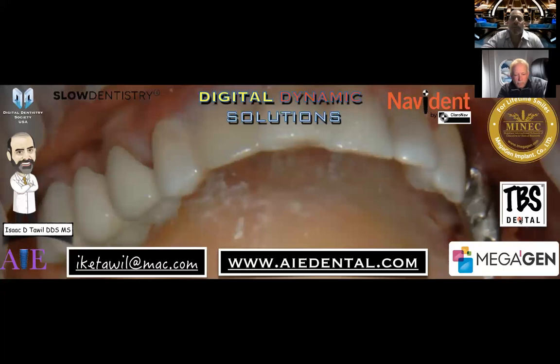However, if I am going to not graft a site and I'm going to come back later to place an implant, if I have a big ridge that I've grafted with a xenograft and I come back in and drill in reverse and compact that bone with osteodensification, what's going to happen is I'm going to compress all the vital bone that I've been developing, and I'm going to leave remnants of the xenograft bone.